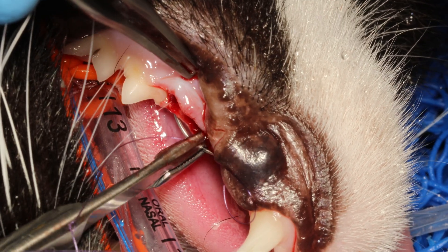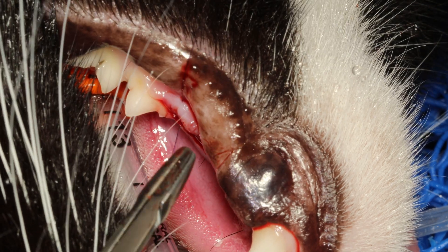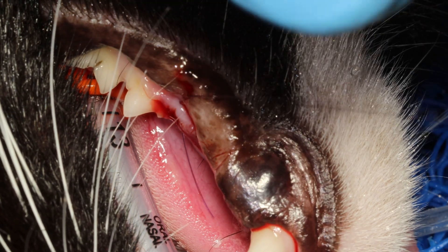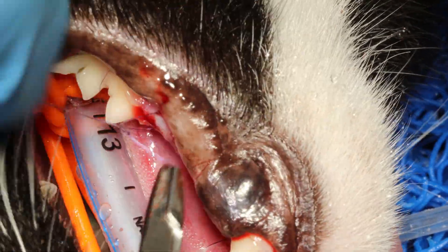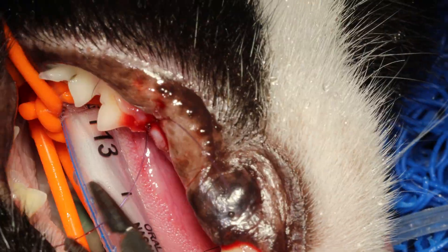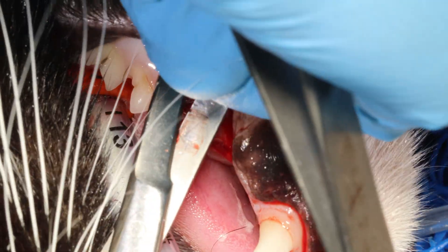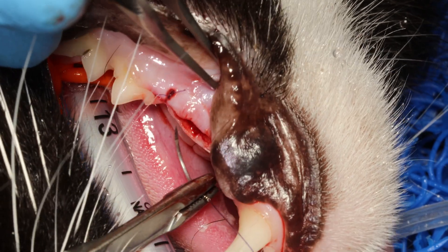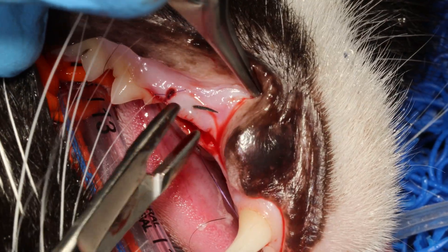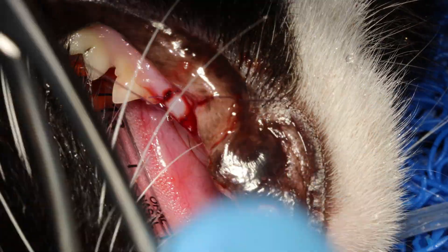I just took that x-ray. The suture I am using is a monocryl 5-0 on a P3 reverse cutting needle. I am going to put 3 stitches here. Make sure you take good bites — at least 3 mm from the edge and about 3 mm apart for each suture.